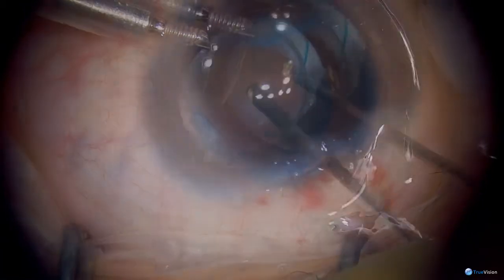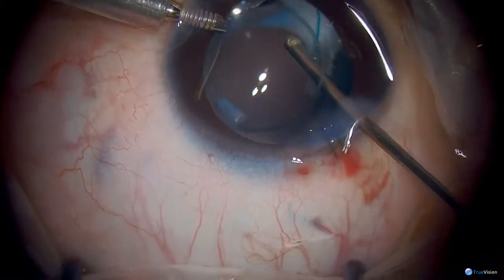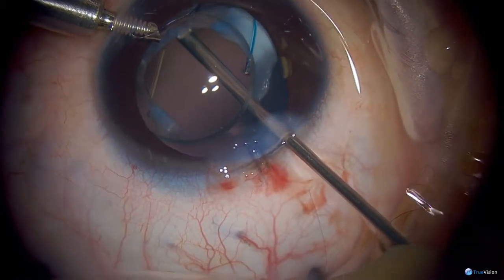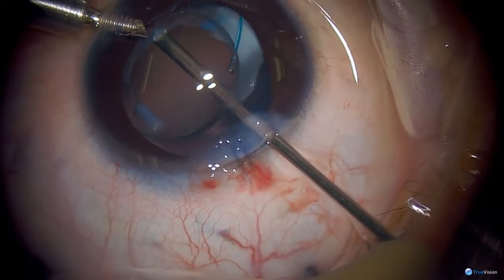So I'm just checking right now, and the opening is still too small to capture the implant. So I'm going to enlarge it some more.